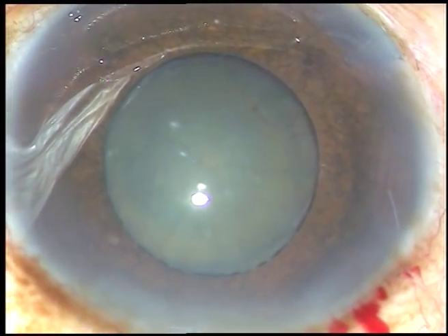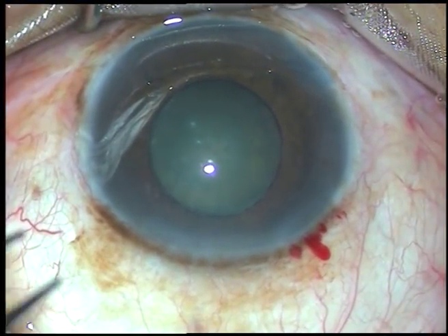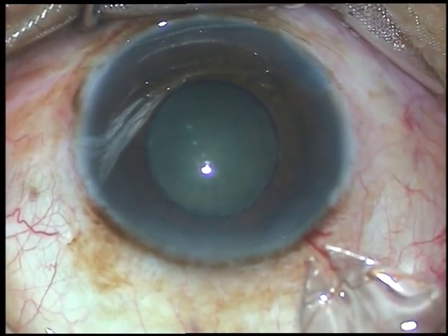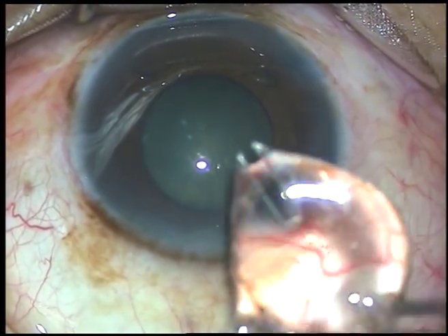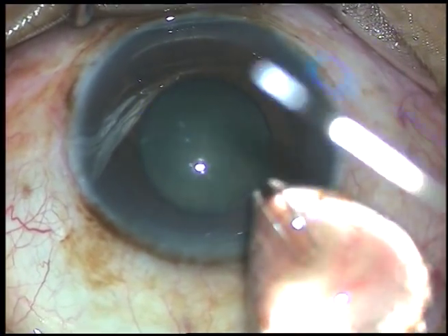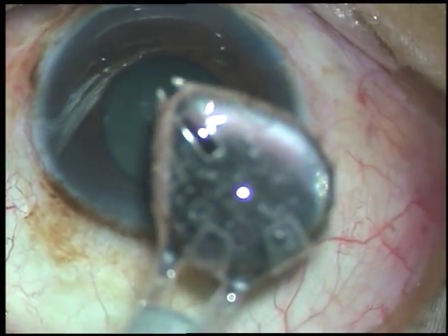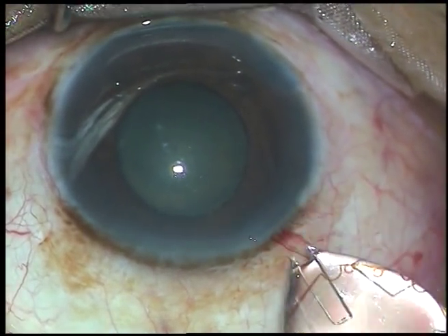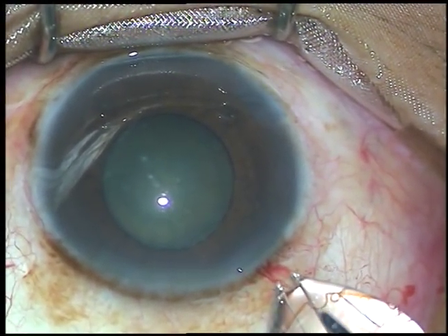In this case I have decided to use a pupil expansion device — it is Bhex, the pupil expander. It is a beautiful hexagonal, versatile, very slender pupil expansion device. This goes through very small incisions — this is a 2.8 mm incision but it can go through very small incisions like 1.8 mm or even smaller than that.